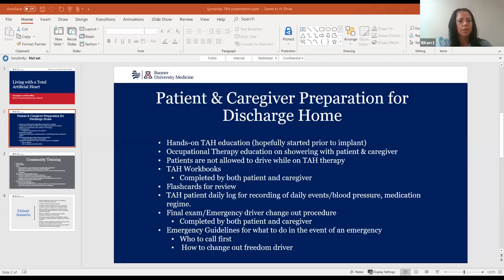Okay. So we're going to talk about discharge home and living with a TAH at home.